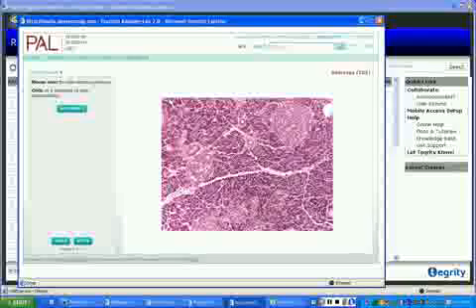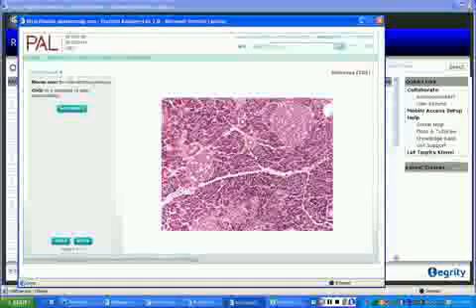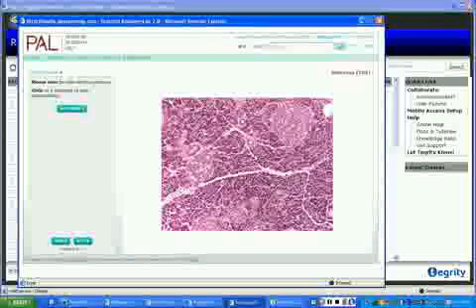So when we're looking at pancreas again later on, maybe at some time in your reviewing, and after we've seen blood and you know what blood cells look like, then you'll be able to see them on every pancreas slide inside of a blood vessel. Okay? So I'll use that to help you later on.